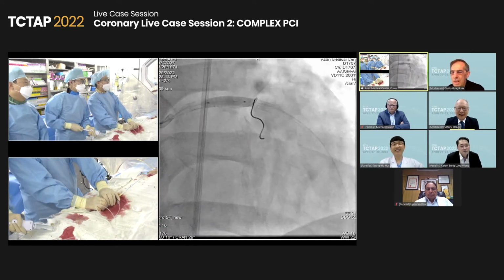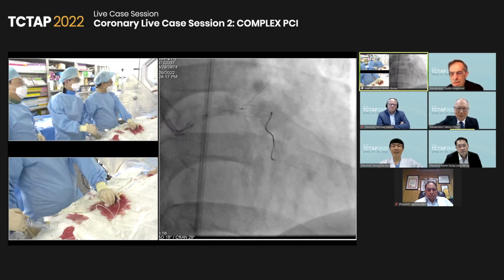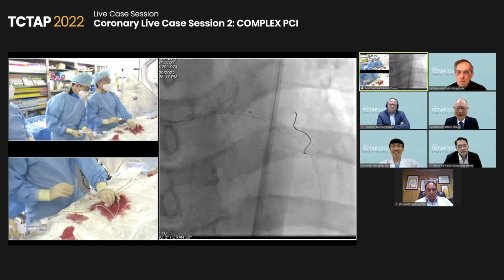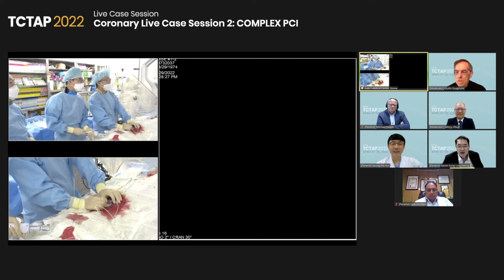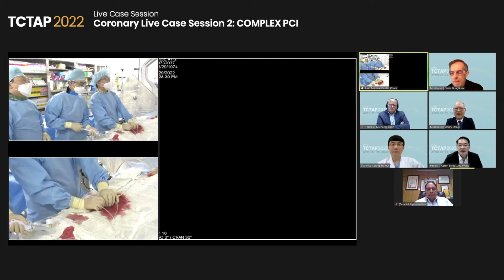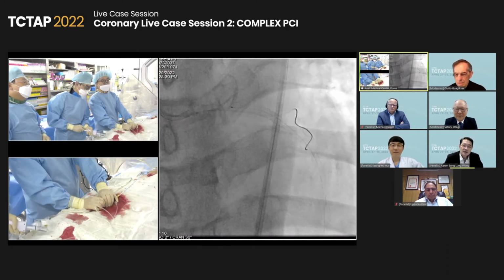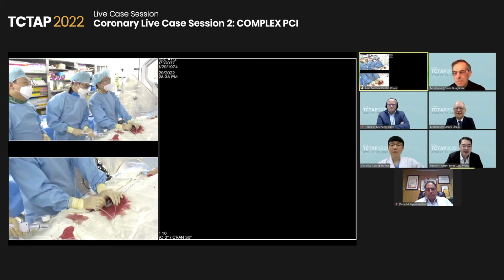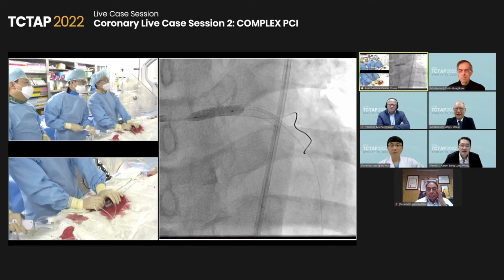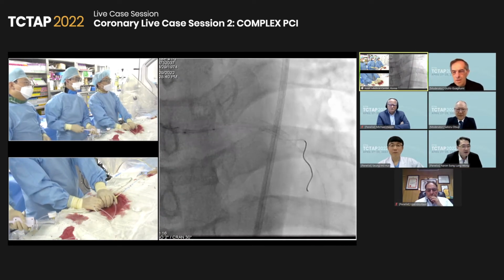Especially because sometimes the stent is elongated into the aorta. I actually agree with Dr. Satoru that we should do the POT first, because sometimes the balloon may get caught on the stent and the stent is not fully dilated. There may be some shortening of the vessels. So I would do the POT first.